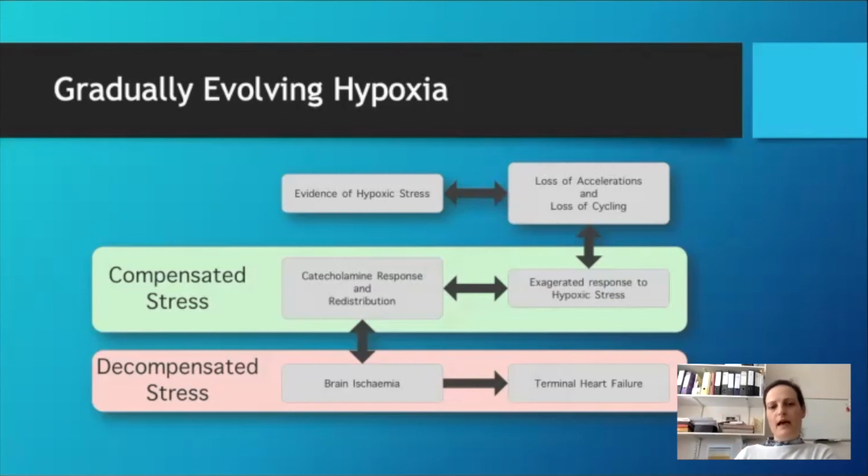And there will be times when you may have some signs of decompensation. If you have STAN on behind, you can trust it. But this needs to be a baby that is not 5 centimeters, it's 8 or 9, and you have done everything to reduce the stress, for example turning off the Syntocinon.